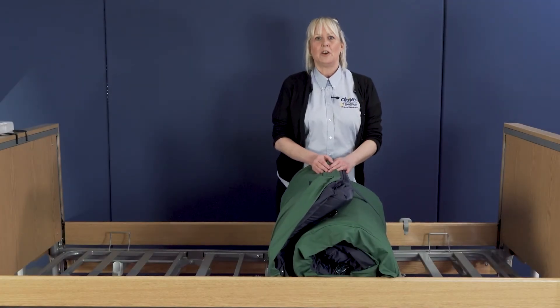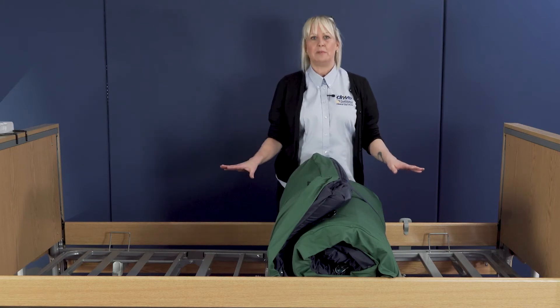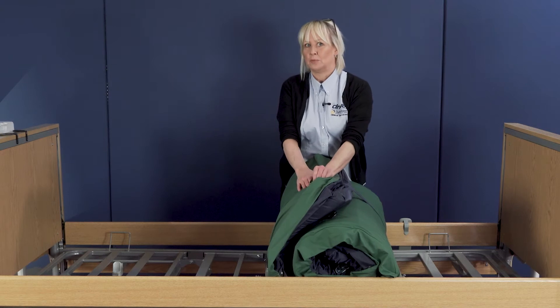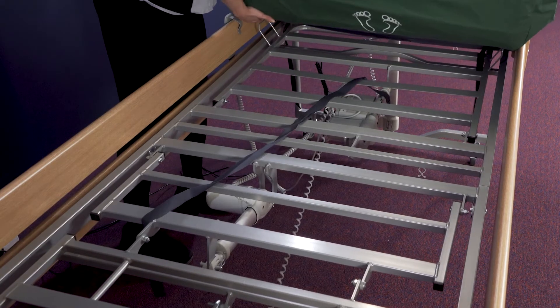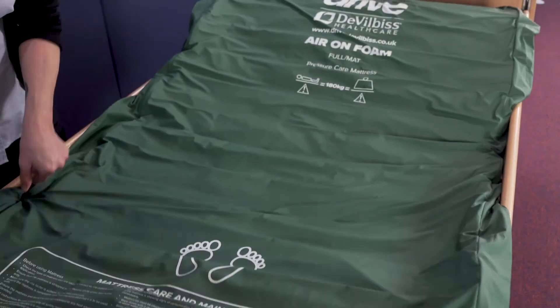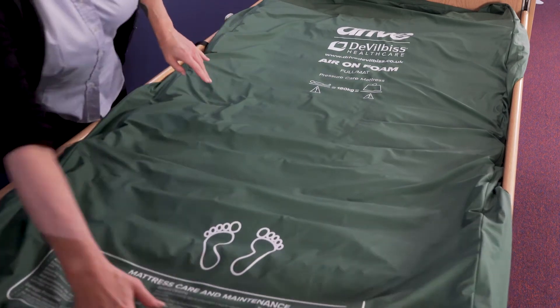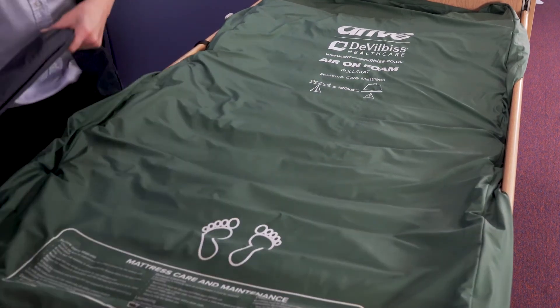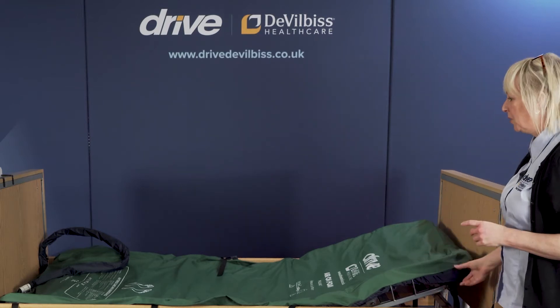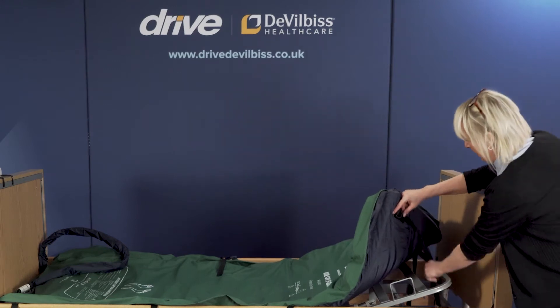To set up the AirOnFoam full replacement mattress, you simply place it onto the bed frame of the bed that you're utilizing, and it does come with a handy transport strap. Simply unclip the strap and roll out the mattress, ensuring that the connector and the feet identifier is placed correctly at the foot end of the bed. There are eight fixing straps on the mattress, and it's really important to ensure you fix all the straps, also to the moving part of the bed frame.